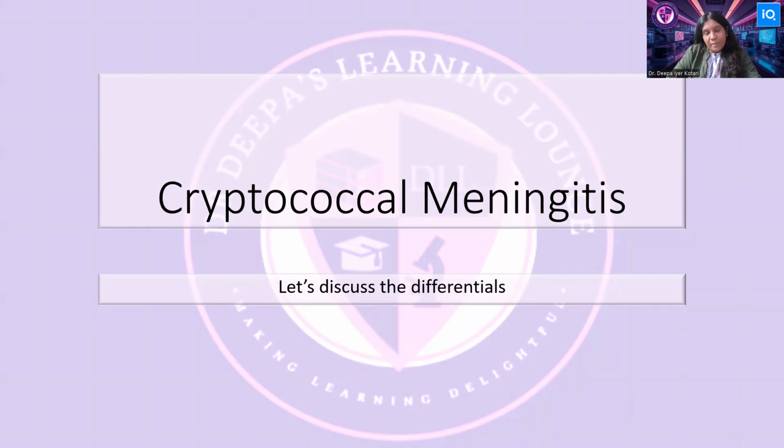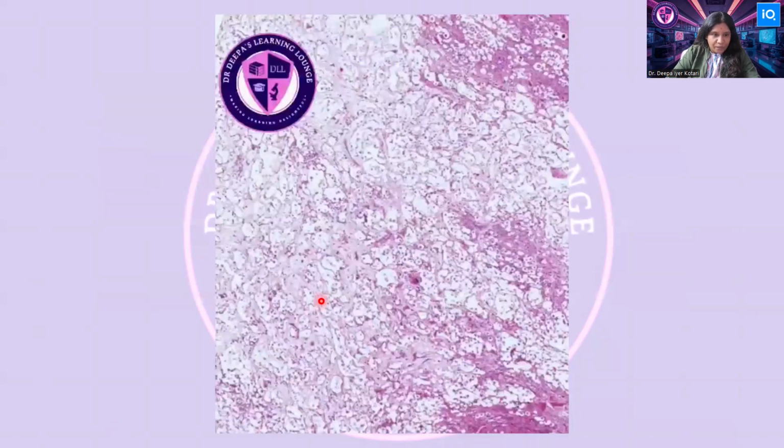I'm here to discuss the case that I shared on the WhatsApp group today. That was a whole slide image of the meninges that had Cryptococcus infection. So we will discuss the details of cryptococcal meningitis today. First, let's look at the whole slide image that I had shared.